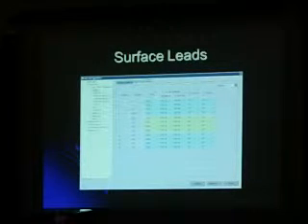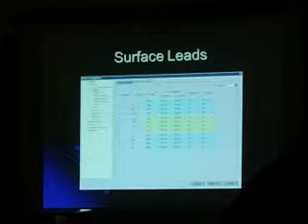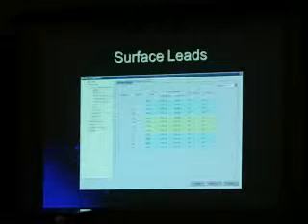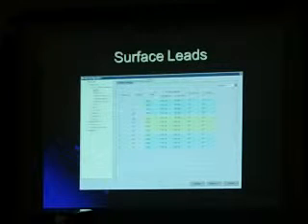What's the low pass? The low pass is your smudge filter. It's set to 100 hertz. That was an RCES question. Yep. What are the filters set for a surface ECG? 0.05 and 100 are the defaults. Okay? And GE will tell you never change these.